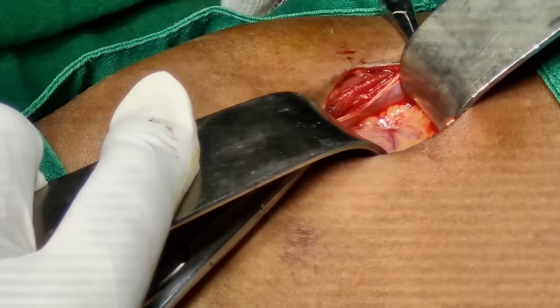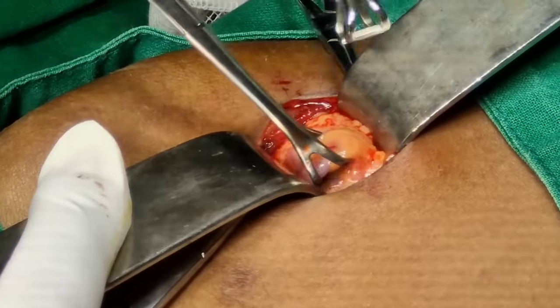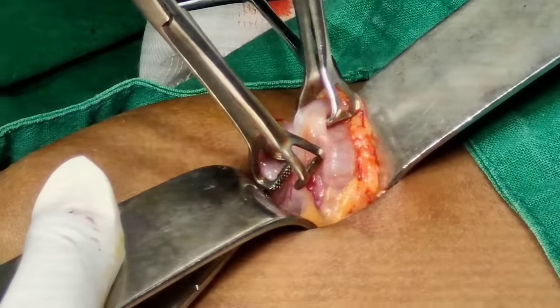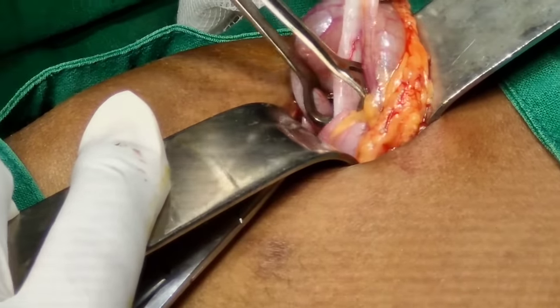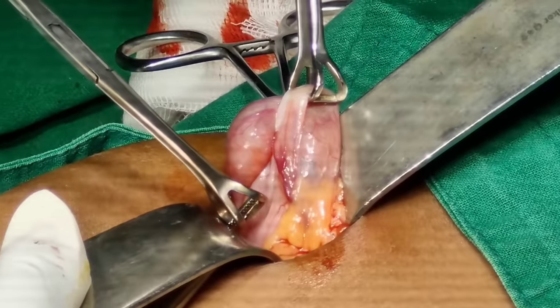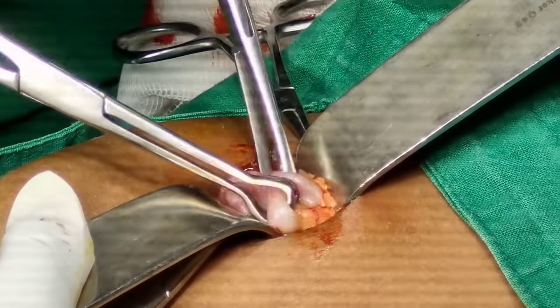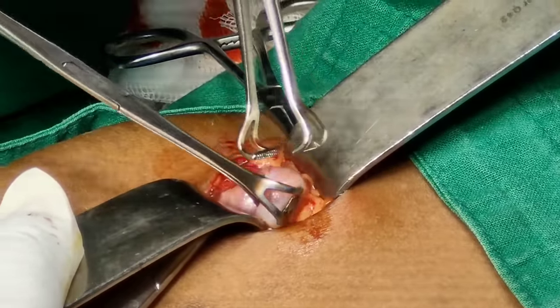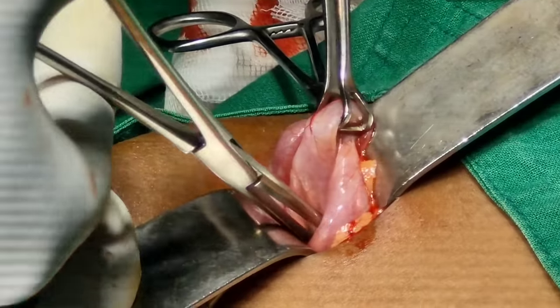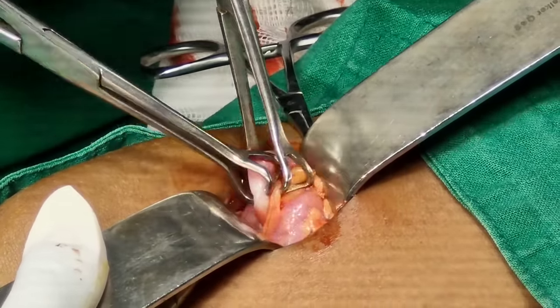After opening the abdominal cavity, use Babcock forceps and hold the cecum over the tenia coli. This whitish band-like structure held in Babcock is the tenia coli. To find the appendix, stretch the tenia inferiorly. During the way, you will come to see the ileocecal junction. 2-3 cm inferior to the ileocecal junction, the appendix lies usually. Observe how gentle movement of Babcock is done to trace the appendix, to avoid injury to the wall.